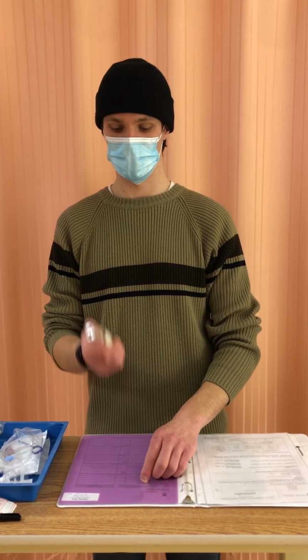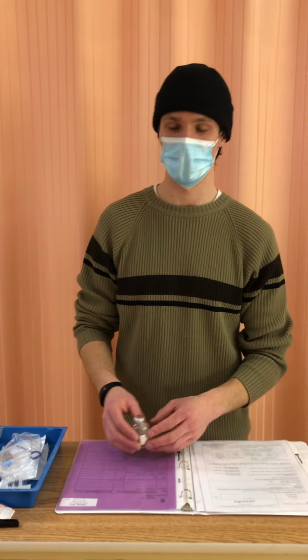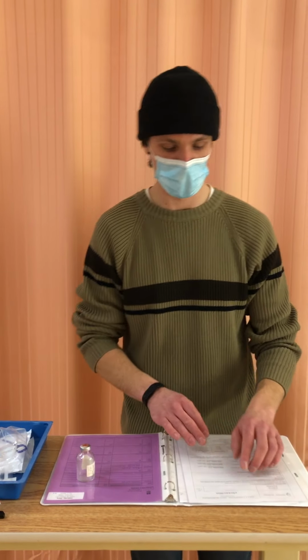Should be given intravenously. This is meant for IV use. Should be given every 6 hours, and it's scheduled for now. Time is now, so correct time and frequency. So now I'm just going to take a peek at the PDM here.